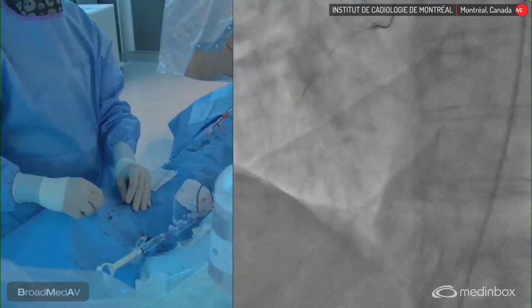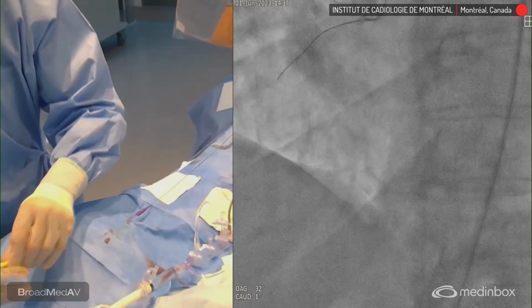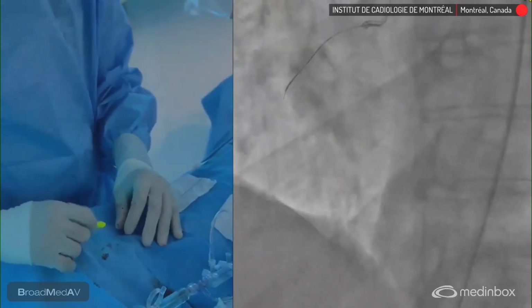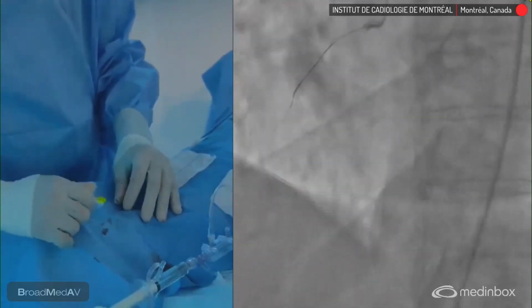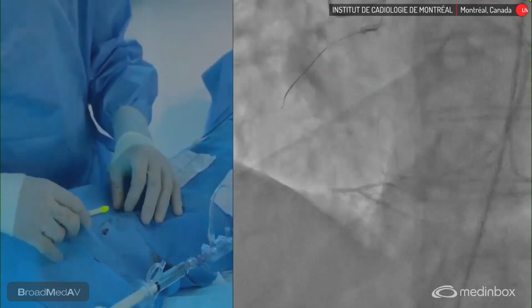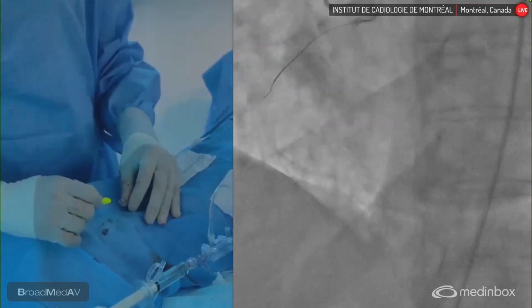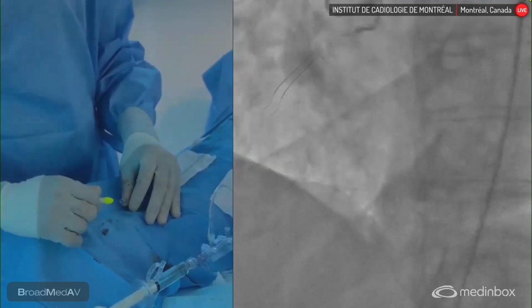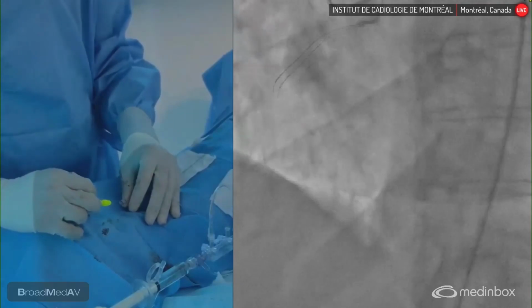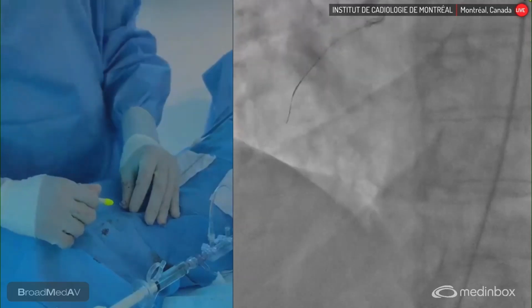I think we're having some resistance at the lesion because my guiding was protruding outwards. So let's see what the Gladius does. So your tip shape of this wire in order to progress, was this pretty much the same as previously? Same. But with the knowledge that it will knuckle in a much more controlled fashion. And your objective now is to re-entry or knuckle? I'm trying to re-enter. I'm going to try to find another microchannel that re-enters. It's a very good wire to direct, and I think my tip is free.